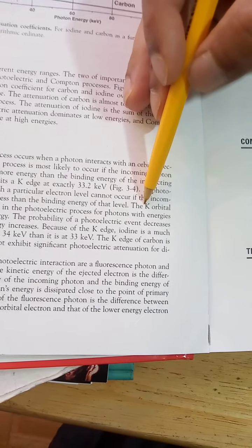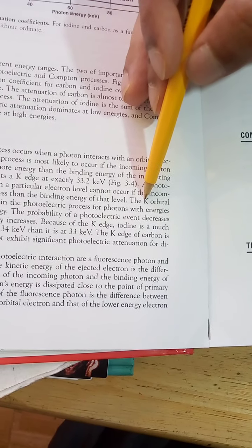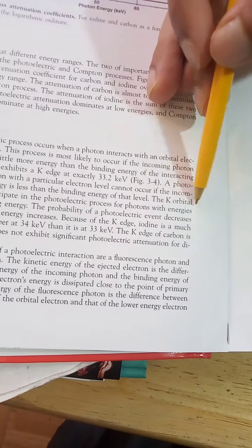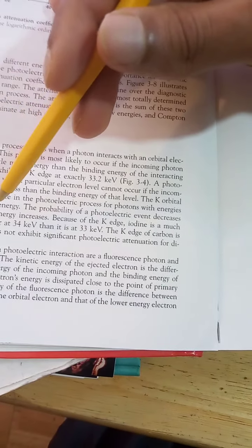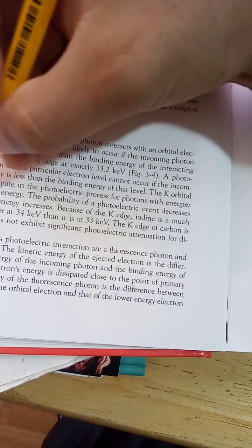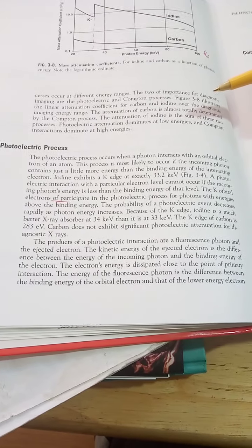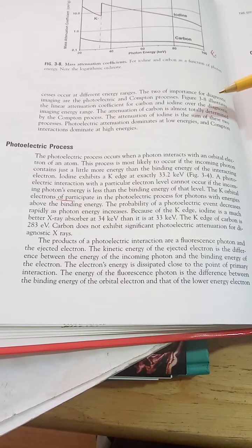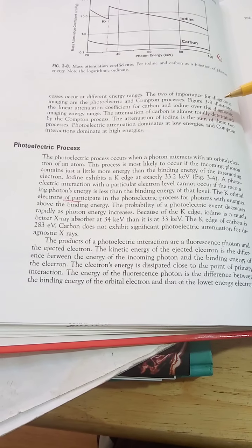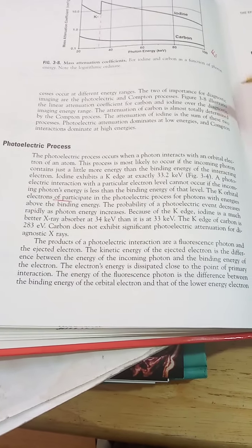K orbital electrons of the element participate in the photoelectric process for photons with energies above the binding energy. I think there's a mistake here. They should have mentioned the element. So the process is more likely to occur if the incoming photon contains just a little bit more energy than the interacting electron. The probability of photoelectric emission event decreases rapidly as the photon energy increases.